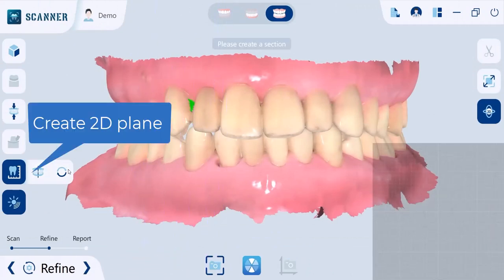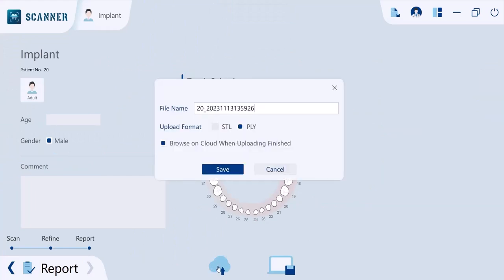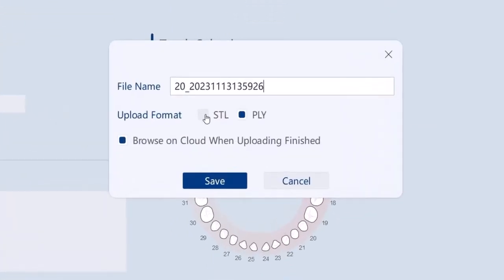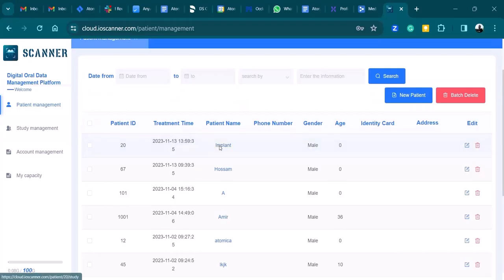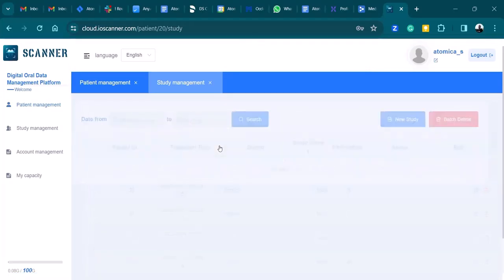Finally, you can export the model in both STL and PLY formats, then save to your disk or on cloud storage so that you can access your patient data anywhere, anytime. I hope you enjoyed this video — stay tuned for more.